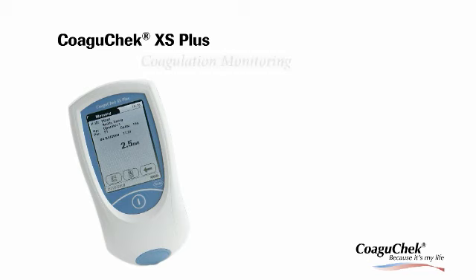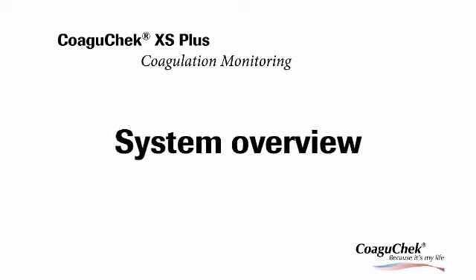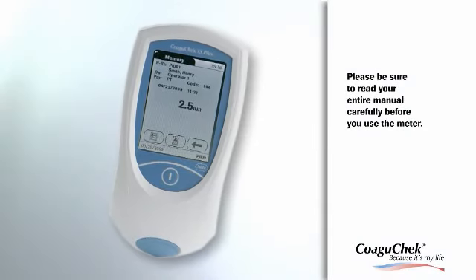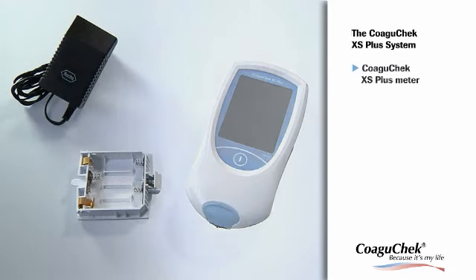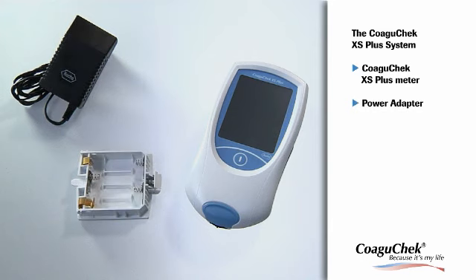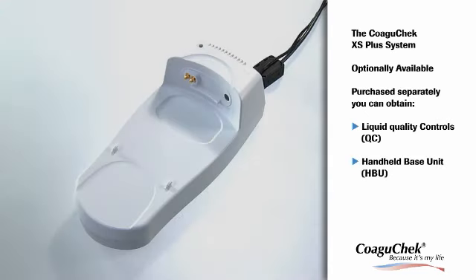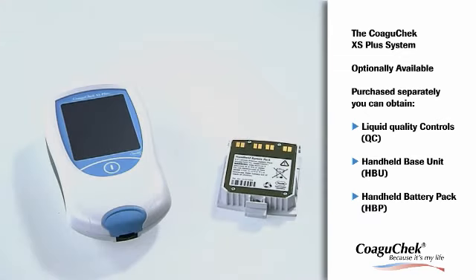Coagichek XS Plus Coagulation Monitoring. Please be sure to read your entire manual carefully before you use the meter. You can use the Coagichek XS Plus meter either with the power adapter or with batteries. The Operator's Manual gives you detailed information about the use of the meter, and a CD-ROM contains the Operator's Manual in different languages. You can use the optional Coagichek XS PT controls with the meter in case your local regulations require liquid controls. The optional Handheld Base Unit provides connectivity to a data management system. The rechargeable Handheld Battery Pack can also be used instead of batteries.